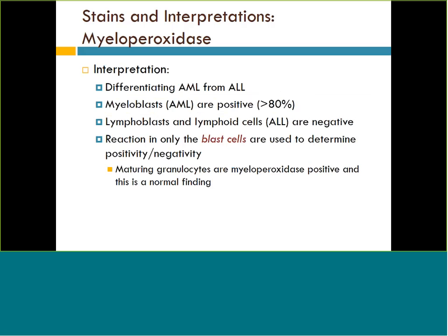They're large, they have dark blue cytoplasm, they have nucleoli in them, they just look alike. So when people have different leukemias, it's going to be affecting one cell line for that leukemia. And so we have to determine what blast cell this is, because by knowing which type of blast it is, it tells us which type of leukemia it is.